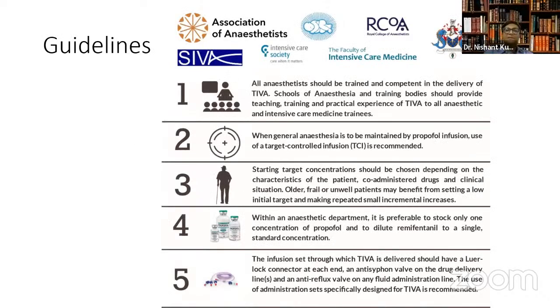Now, these are the guidelines: TIVA TCI is the future. So all anesthetists should be trained and competent in the delivery of TIVA. And it is a duty of the teaching institutes to provide this training. TCI is always recommended over other techniques. And again, the TCI concentration should be titrated, as I said, for elderly and ASA 3 patients, vulnerable patients, you have to go slow.